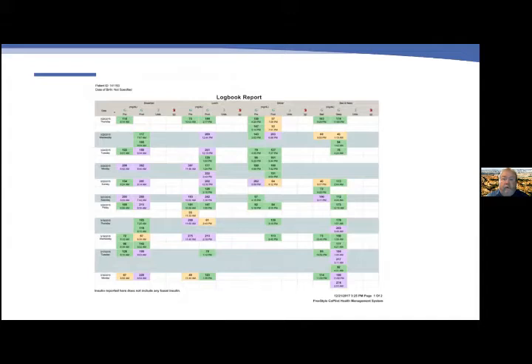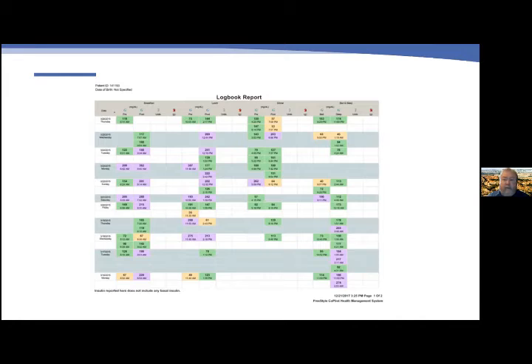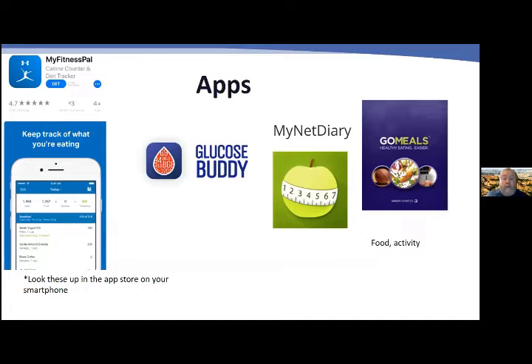This is a typical smart meter download logbook. Green values are in range, defined as 70–180 by the ADA; yellow represents hypoglycemia below 70; and purple represents elevated blood sugars above that threshold. This patient is checking four to six times a day. I would identify post-breakfast hyperglycemia and occasionally some post-supper hyperglycemia, which we could address with med adjustments or lifestyle factors.